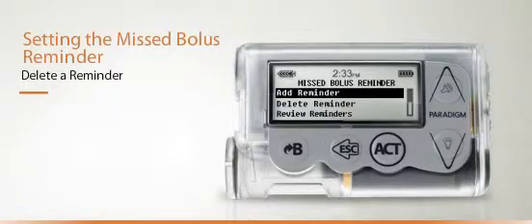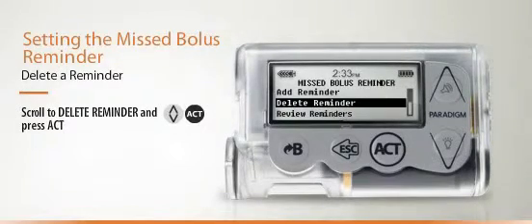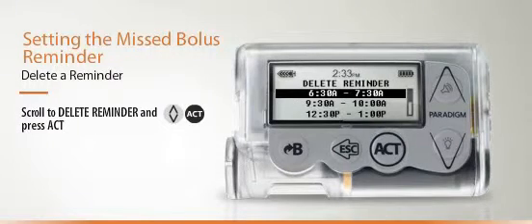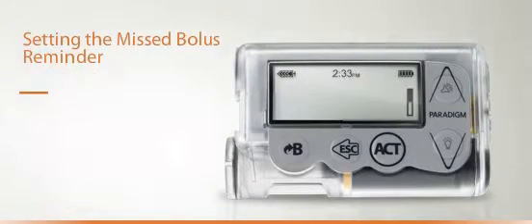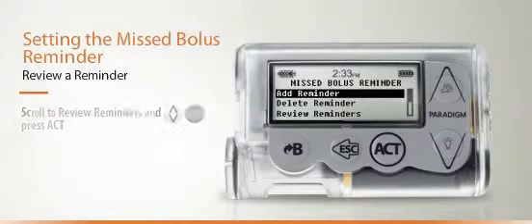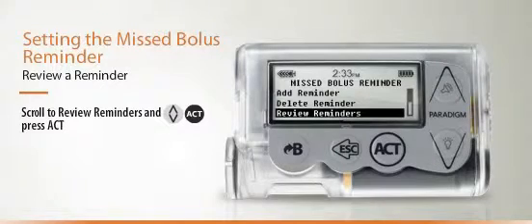To delete a reminder, scroll to Delete Reminder and press Act. Highlight the reminder you would like to delete and press Act again. To review all missed bolus reminders, scroll to Review Reminders and press Act.